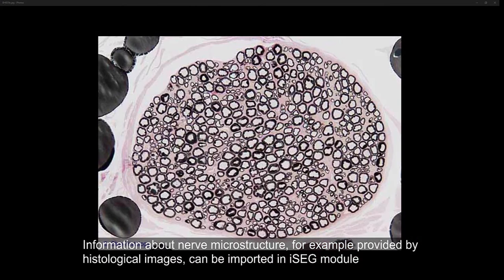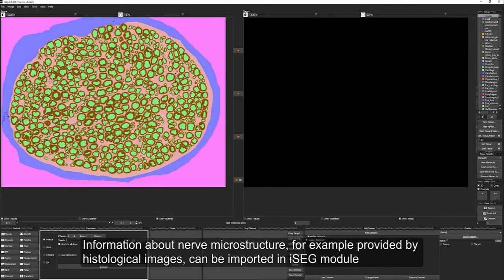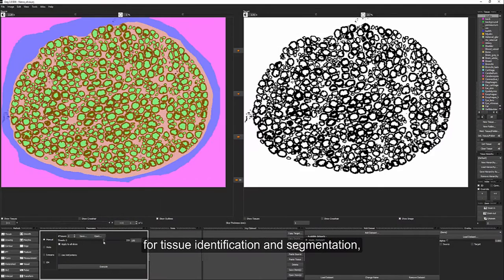Information about nerve microstructure, for example provided by histological images, can be imported in iSEG module.